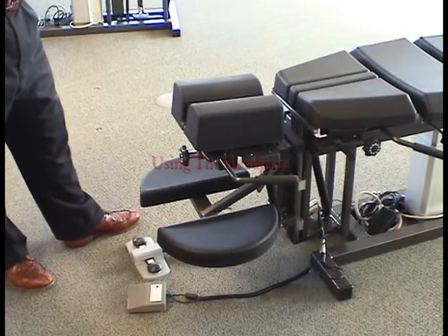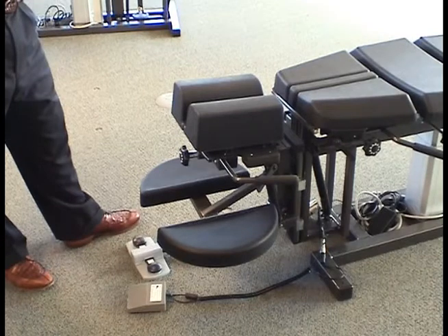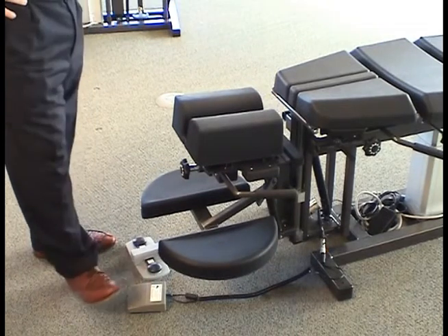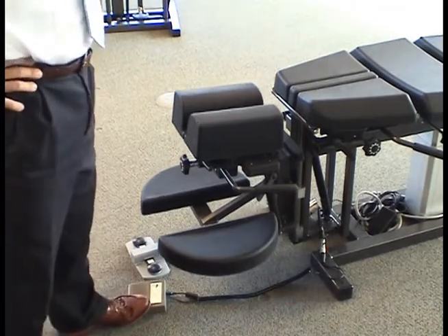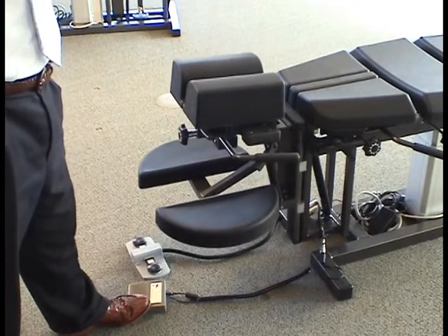Using the headpiece. The PCT headpiece is raised and lowered electrically. While remaining horizontal, the headpiece can be lowered 3 inches below the thoracic piece, 19.5 inches from the floor. It can be raised 8 inches above the thoracic piece, 29.5 inches from the floor.